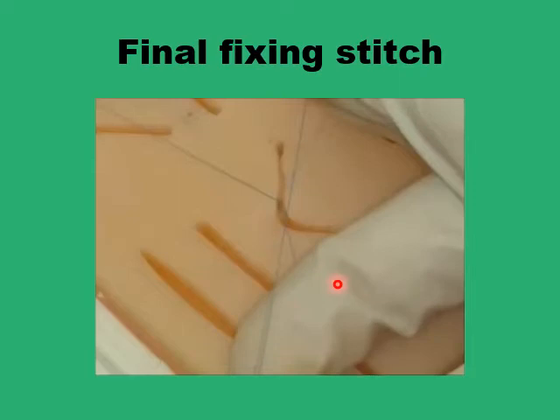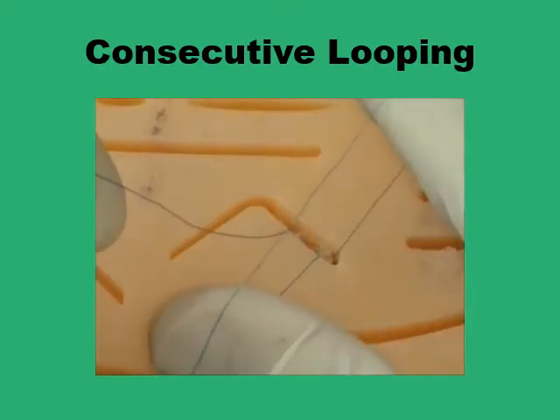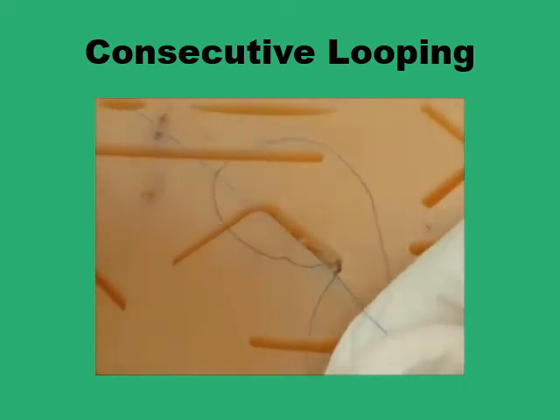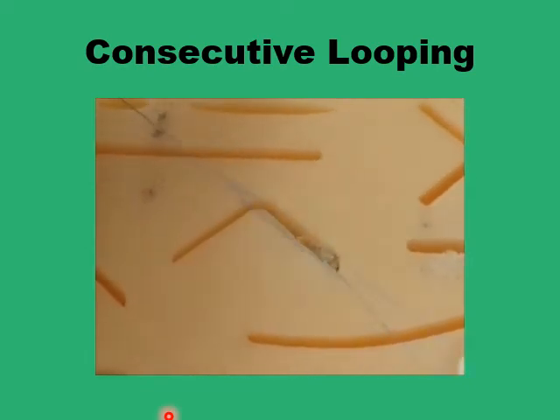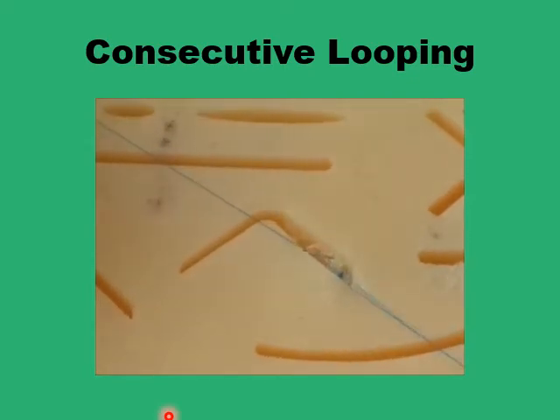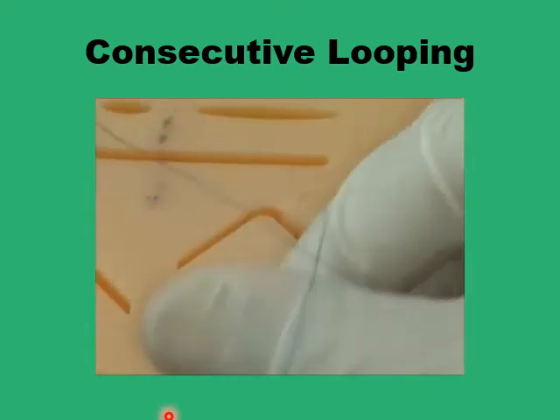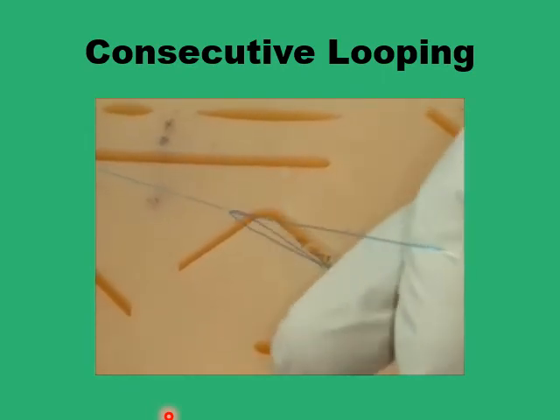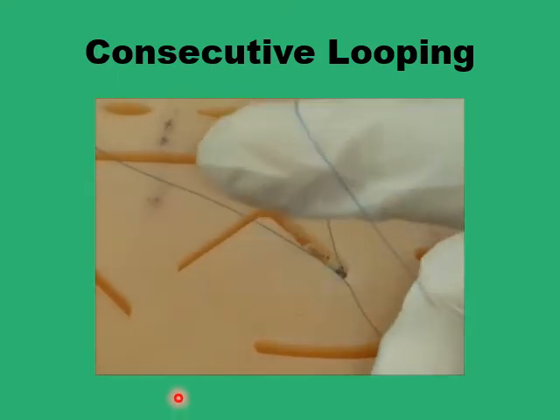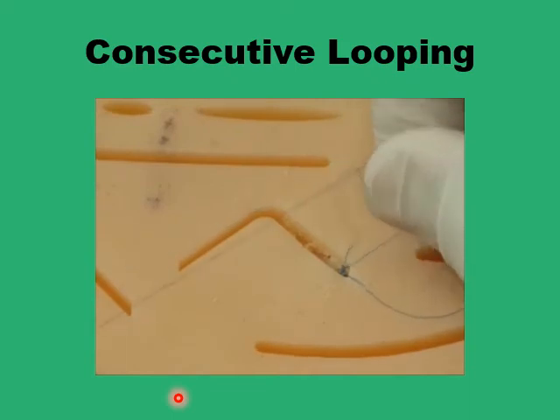Through this loop, you try and pinch a little bit of the suture to form another new loop. So you just go through that loop, pinch a little bit of the suture, another loop is formed, and you pull so that you start forming the knot, then go on pulling once more. You get a new loop and add a little bit more to the knot. Continue pinching a little bit of the strand between two fingers and pulling through to add to the knot.